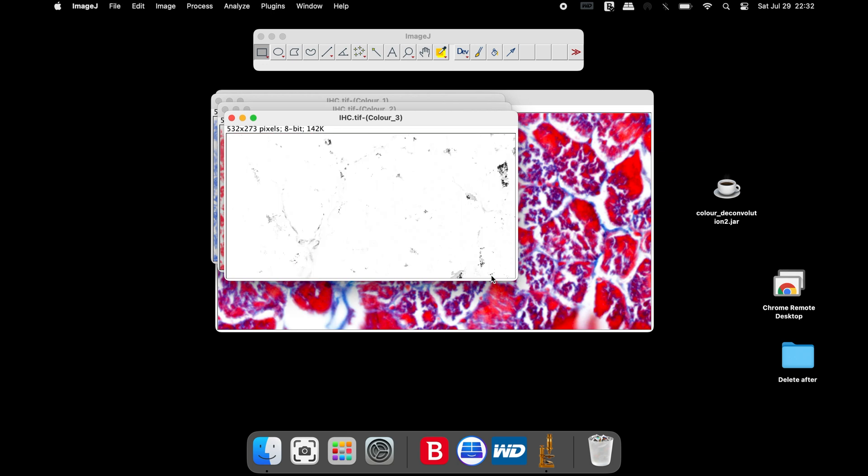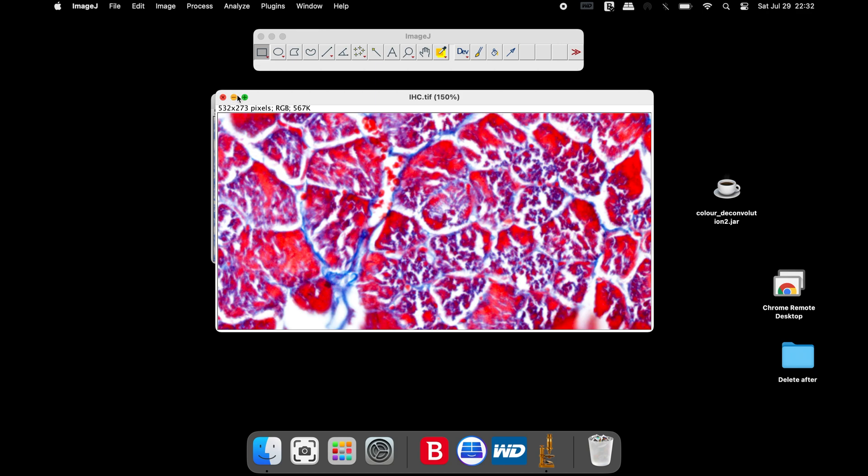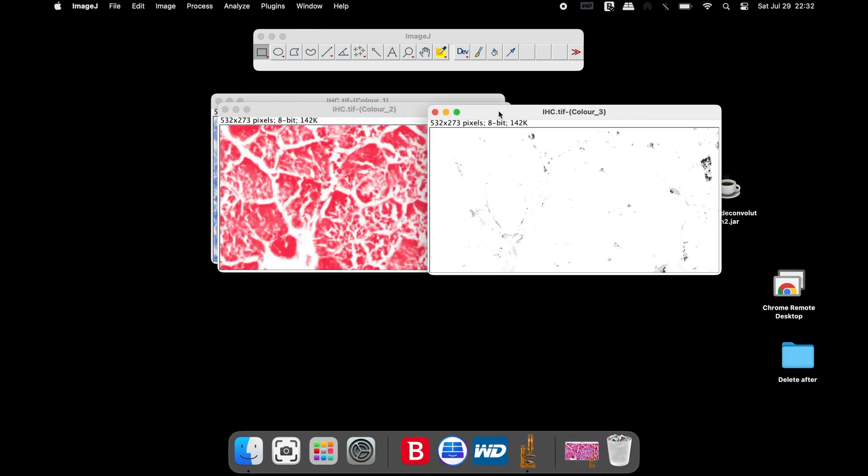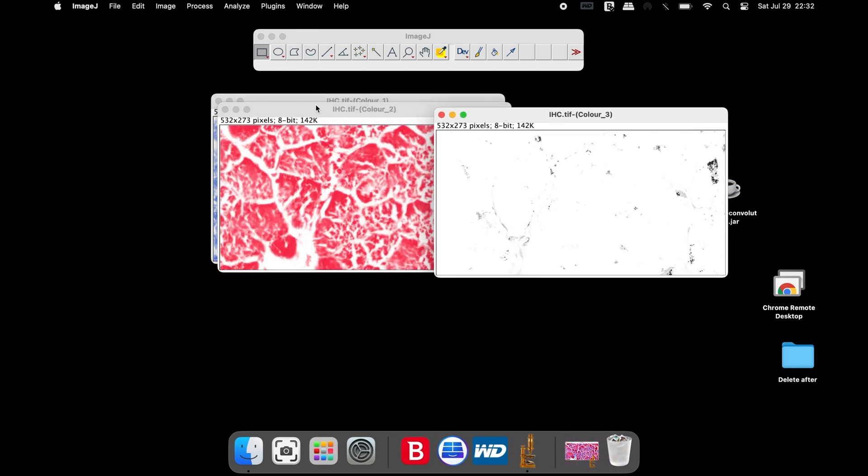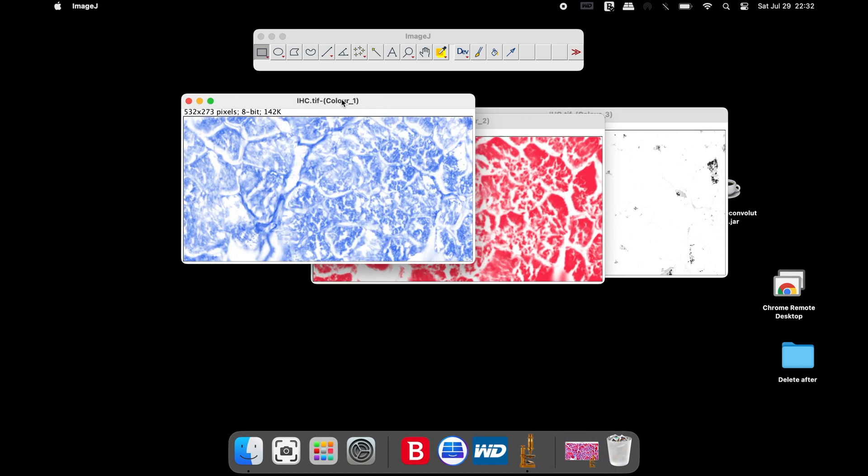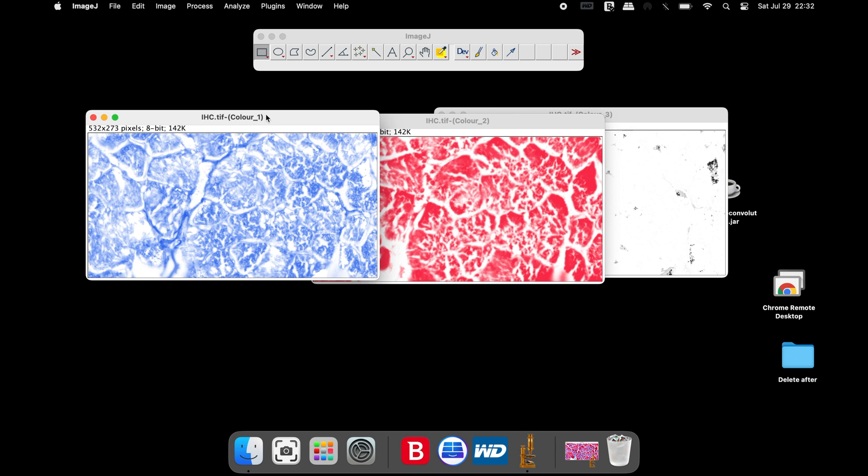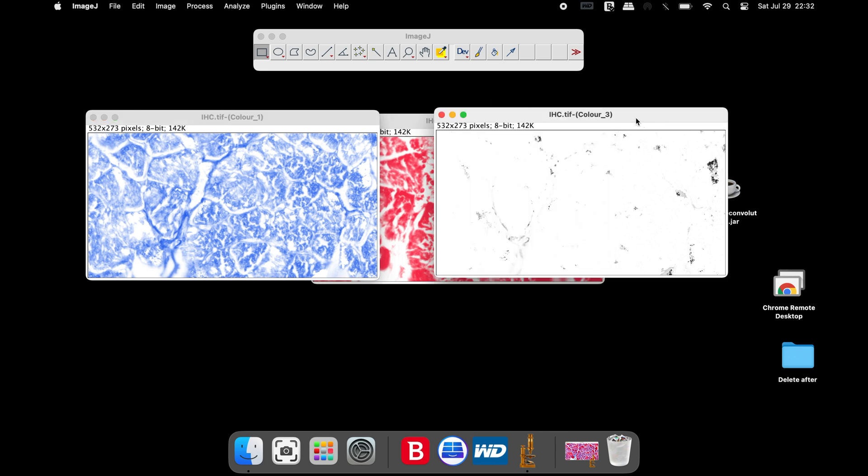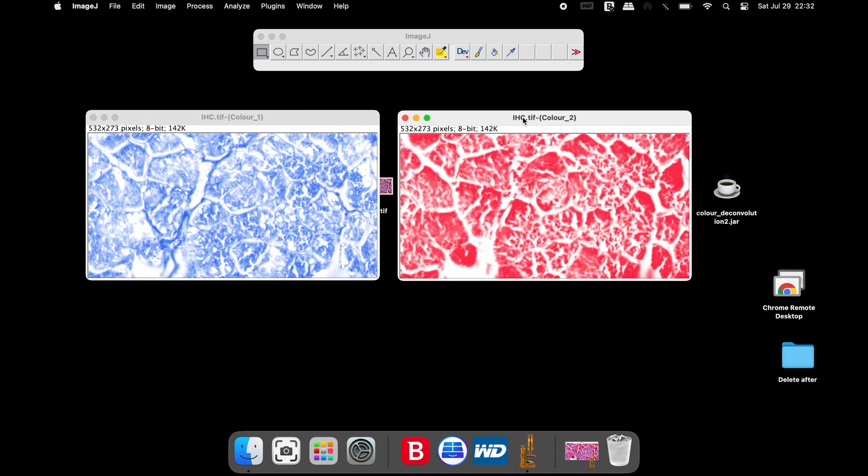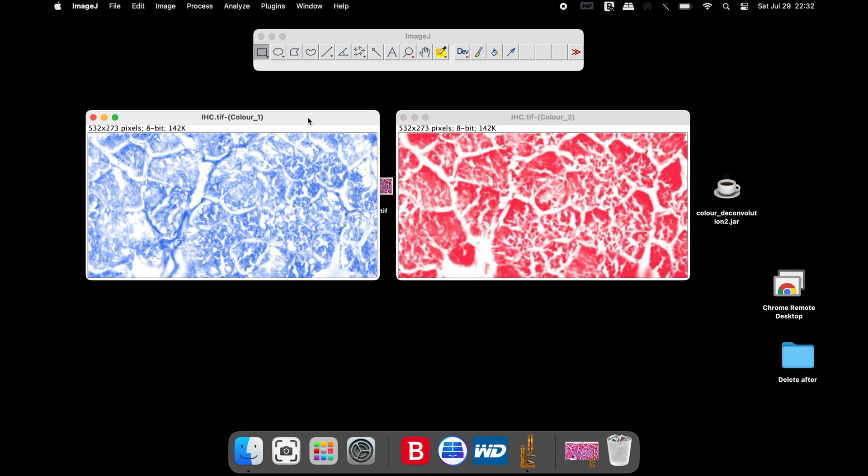At this time, 3 images are generated: Color 3, Color 2, and Color 1. Users can ignore the Color 3 at this moment. Here, the Color 1 image is the collagen stain in blue, and in the Color 2, the muscles are stained in red.